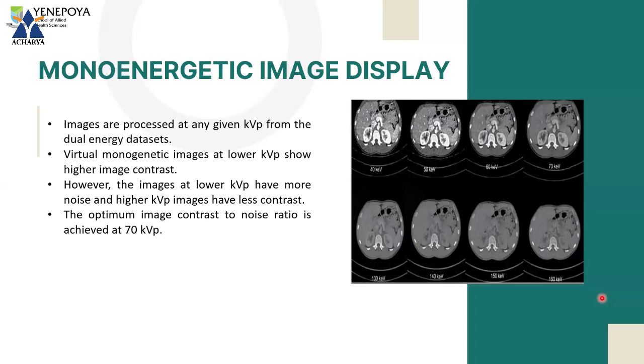It will help you in diagnosis. And because medical imaging is revolutionizing every now and then, the researchers will find a way in which the radiation dose can be reduced when you are using dual energy CT. For now, yes, there is an increase in the radiation dose, but it may not be that significant when you compare it with the pathological differentiation that you will get.